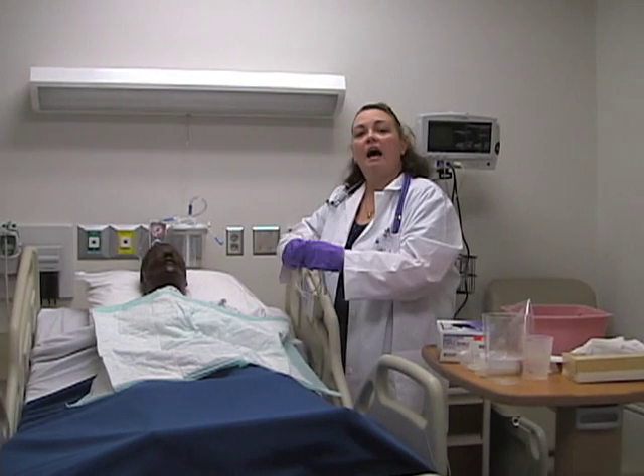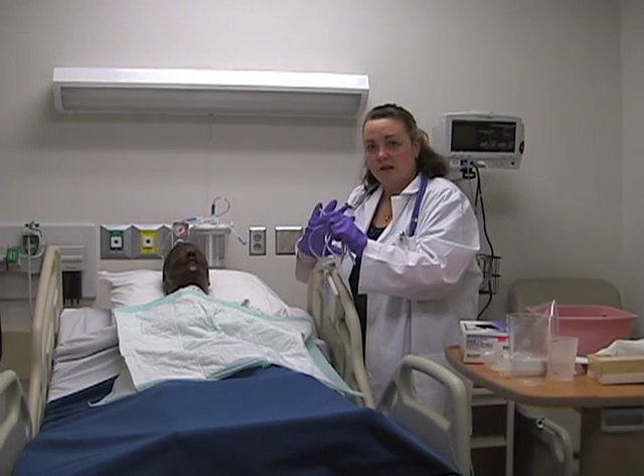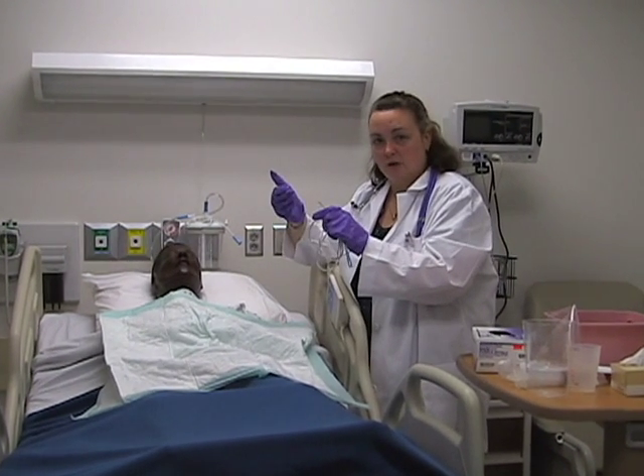A lot of people ask whether this is a sterile procedure — it is not. This is a clean procedure. You do not need to maintain sterile technique.